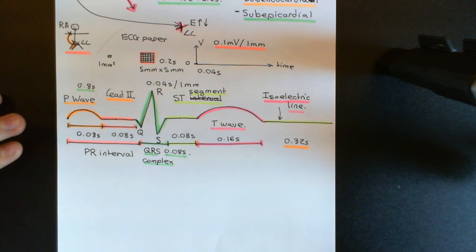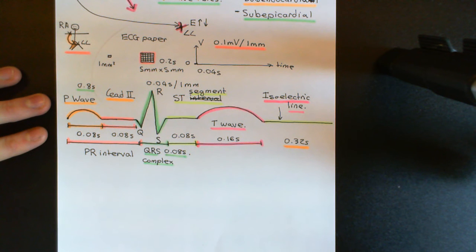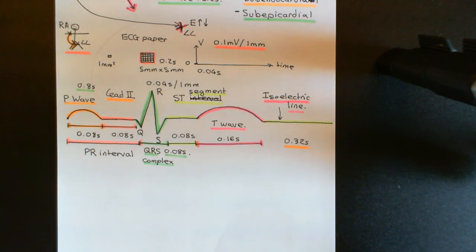Okay? So really, when we look at an ECG pattern like this, although what it is actually measuring is the electrical potential difference between these two different portions of the body, what it's really representing, and the reason it's so useful to us, is that it's showing us how the wave of depolarization is spreading through the heart, how the electrical signal is propagating through the heart, and that's why it's so useful to clinicians.